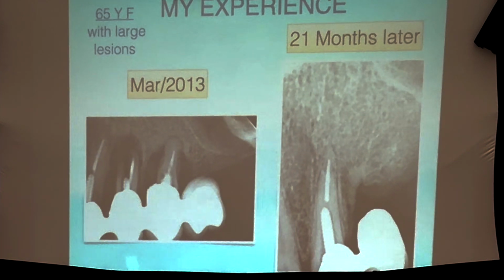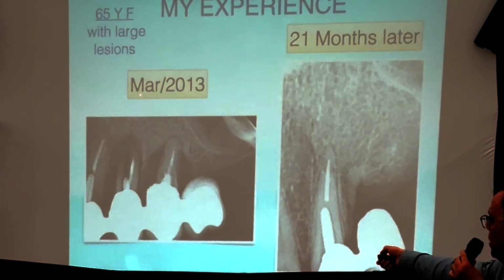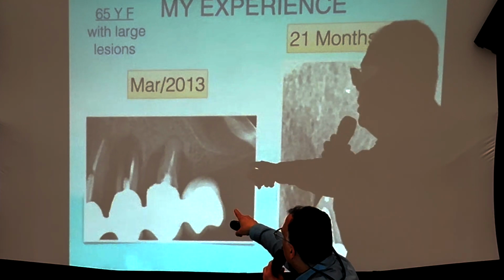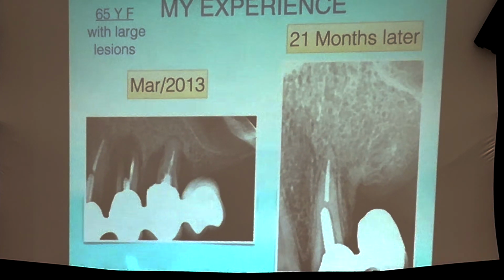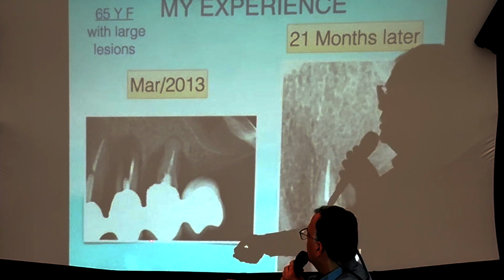And I told her, according to the x-ray, March 2013, that this is quite impossible because you have a fractured tooth here, if you can see. Here, guys, this one. And we have another tooth which was very, very wobbly. And we have a de-cemented post inside the root here. So I told her, look, the best case scenario, we can cut the bridge as I cut it here in the middle. Okay?